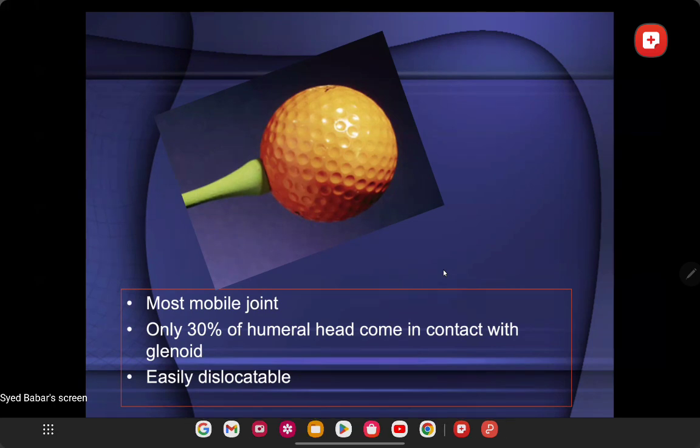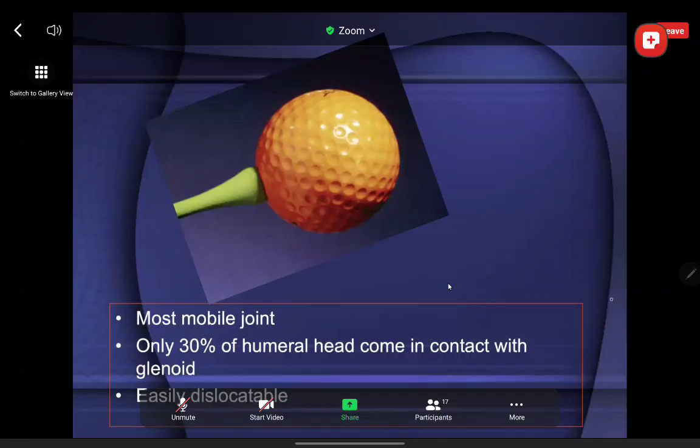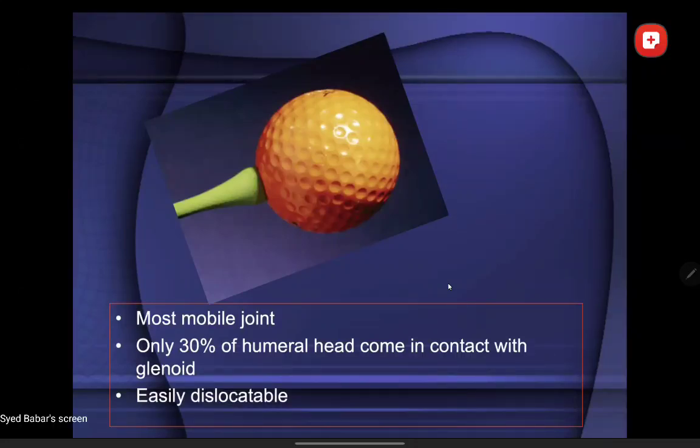The only difference is that ultrasound will not tell you what's going on with the cartilage and the labrum inside the joint, whilst the MR will tell you. Also, the marrow, you won't be able to get any idea as to what's going on with the marrow unless you do an MR scan. And lastly, the muscles. You may be able to see the muscles on ultrasound, but you actually can't figure out if there is fatty infiltration of the muscles. So that's the major difference between ultrasound and MR.